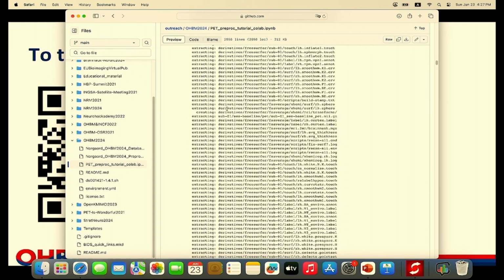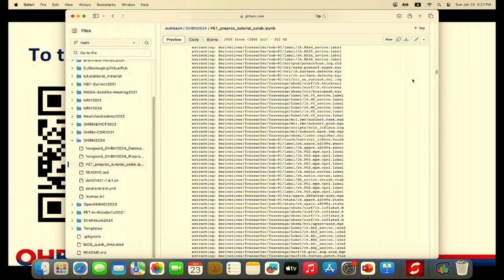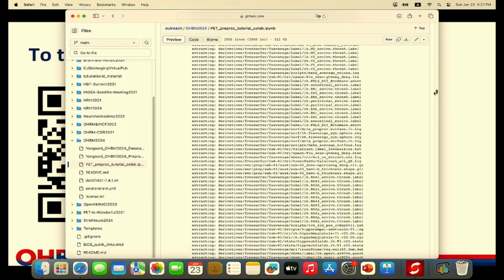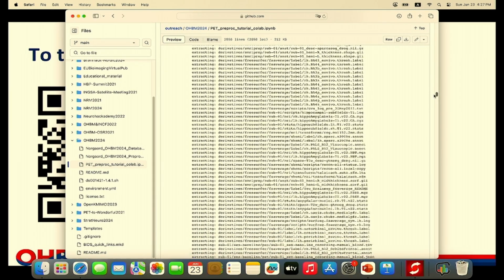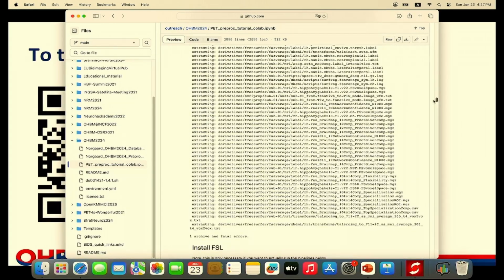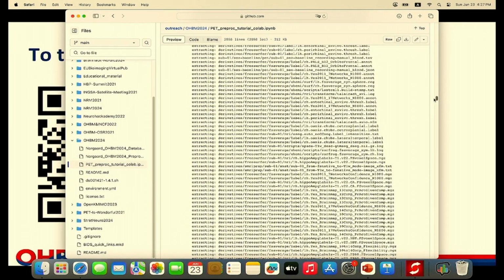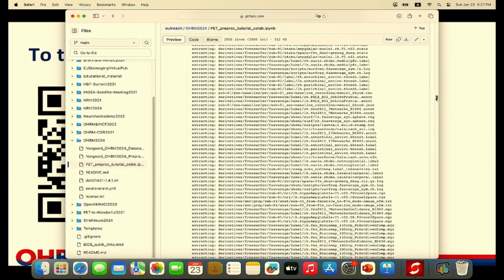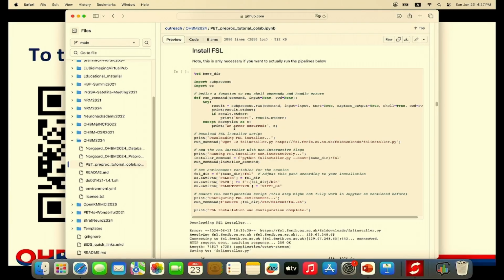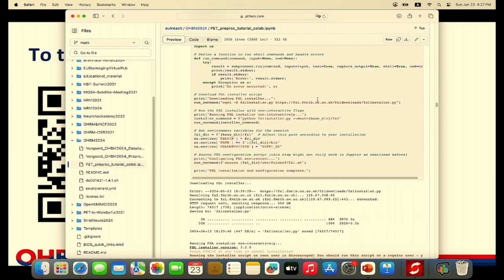If you scroll down further, it's easier. You go through all the FreeSurfer and sMRIPrep outputs. You get further down. And apparently it's not evident from here, but there's also all the outputs from the PETPrep, both the head motion correction workflow and the extraction of time activity curves workflow.